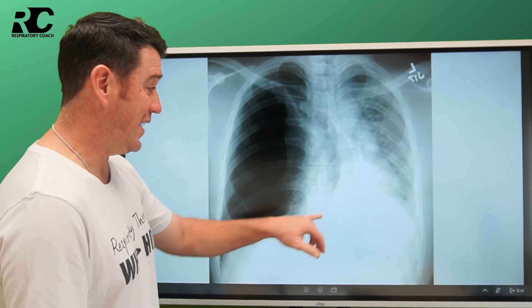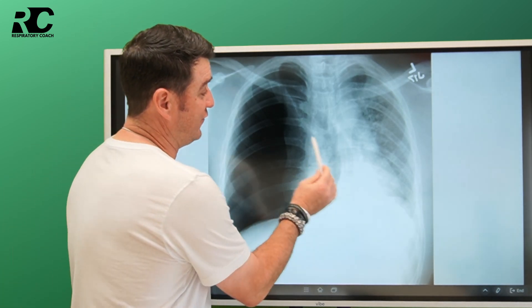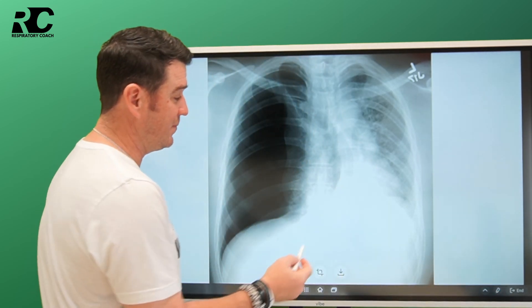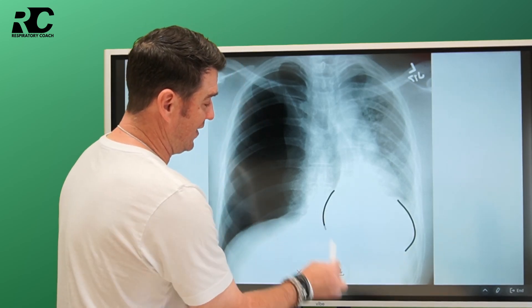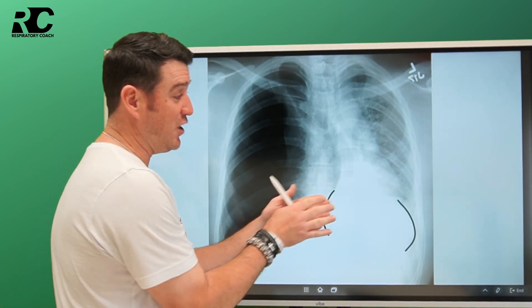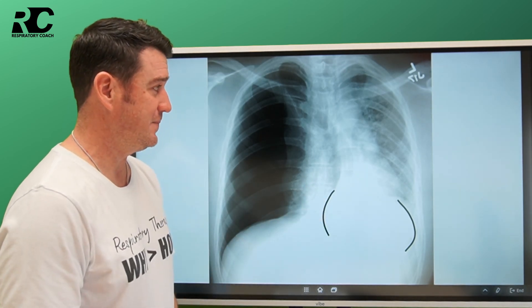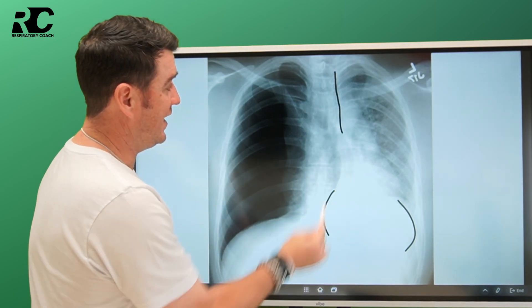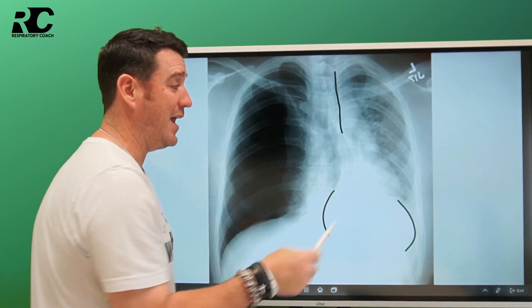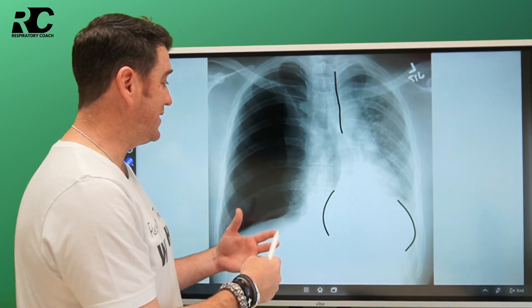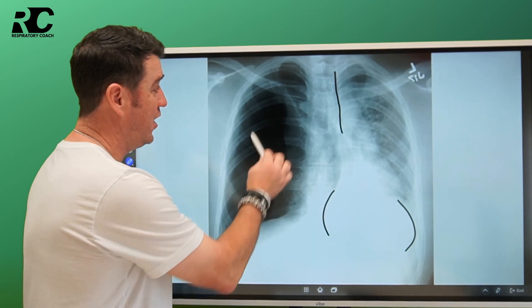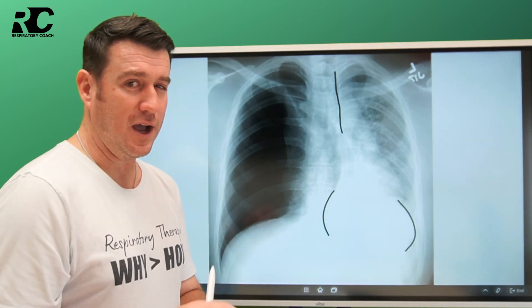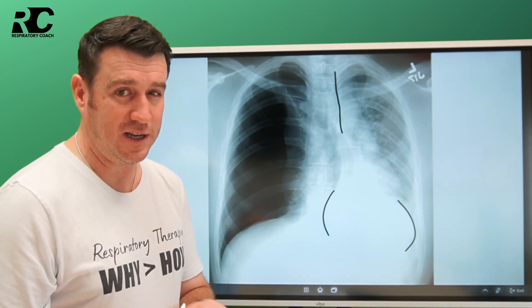I also noticed that the mediastinum is shifted. The heart border is right about here, shifted over to our patient's left. The carina is shifted over as well. Over on this side where I have increased radiolucency, I don't see any lung markings, and that's a big giveaway.